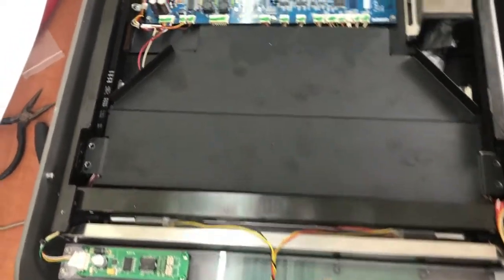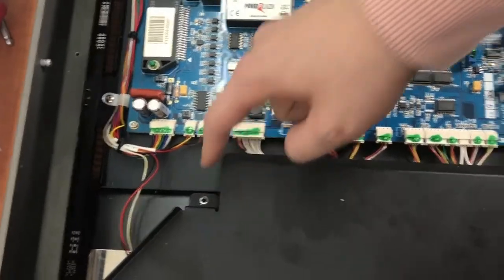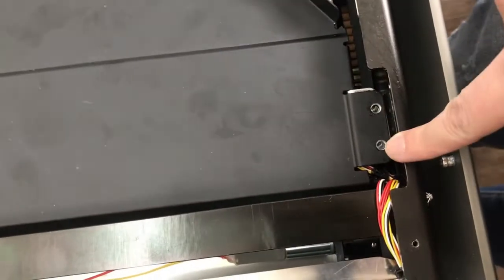First, take off all the cover. You can see there are six screws in here — one, two, three, four, five, and six.